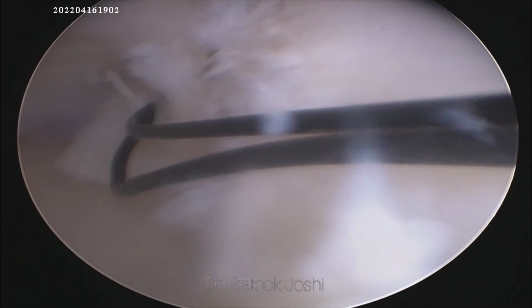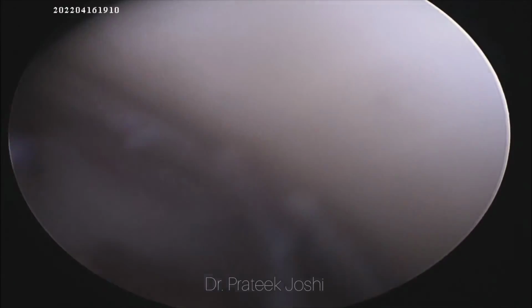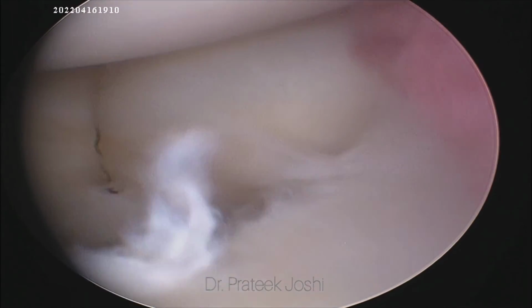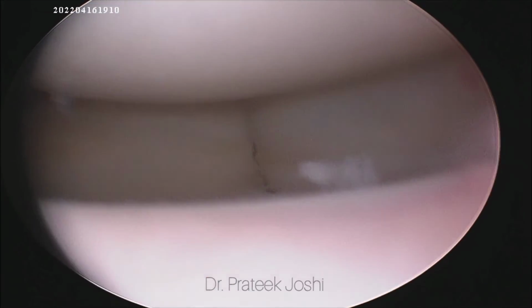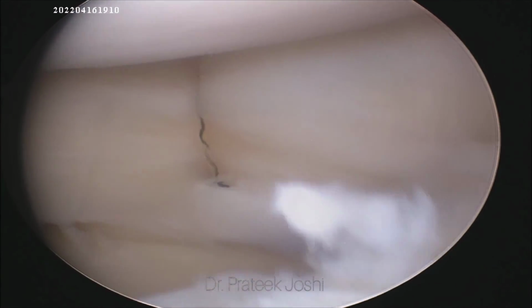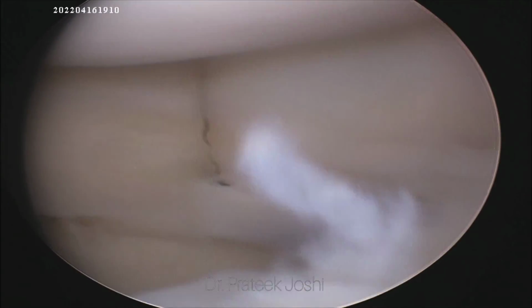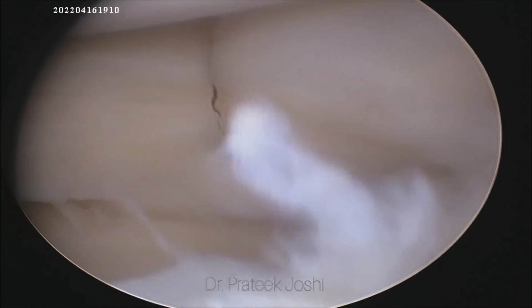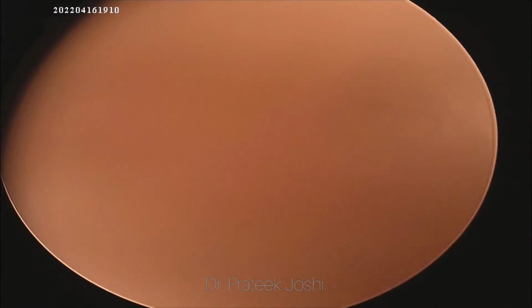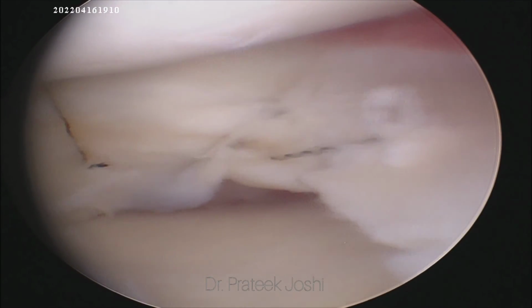So as you can see that we have passed the fiber wire in horizontal mattress configuration by using the outside-in technique, and this is the picture of meniscus after tying the knot as seen from the anteromedial portal. And this is how the repair looks from the anterolateral portal.